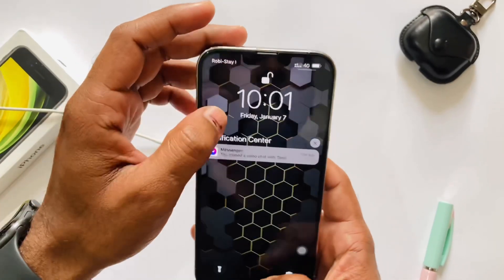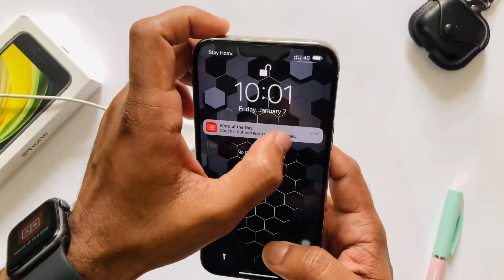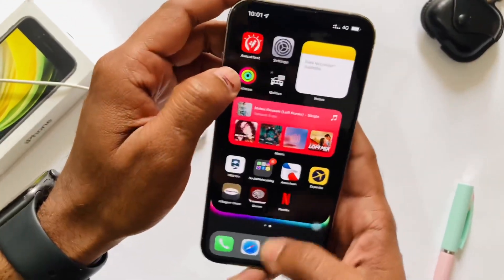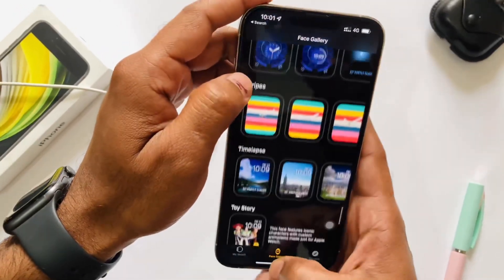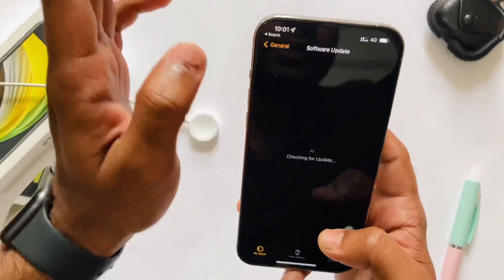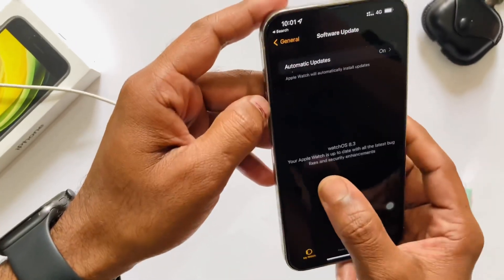First, I just updated my ECG — so for this, you have to make sure your Apple Watch is up to date. To check this, you have to go inside the Apple Watch app on your iPhone, and inside the watchOS section you can see whether your watch is up to date or not.